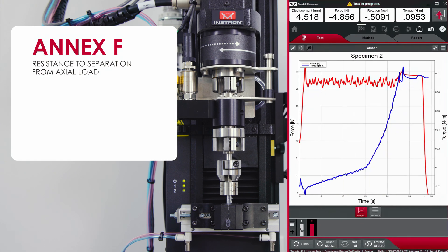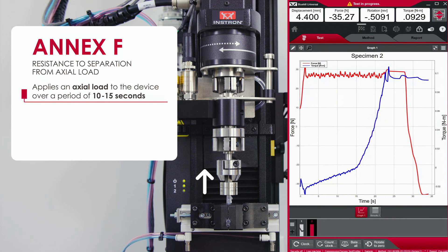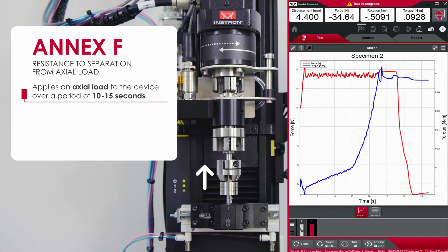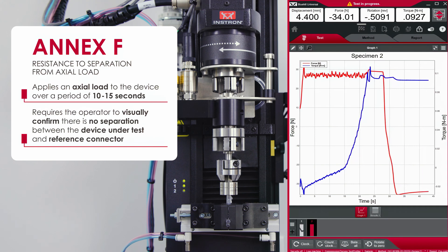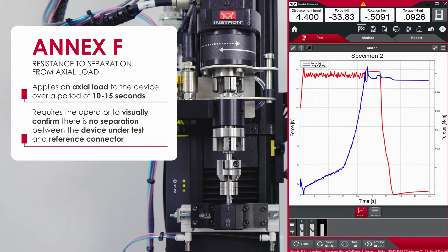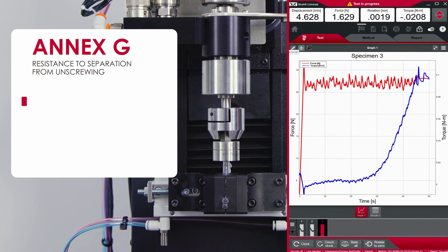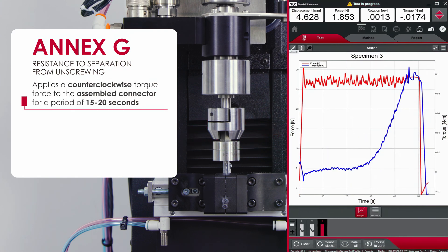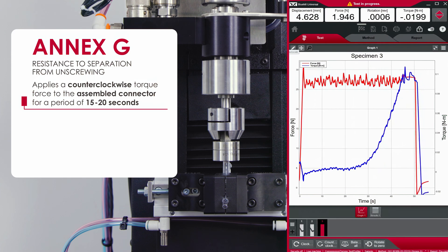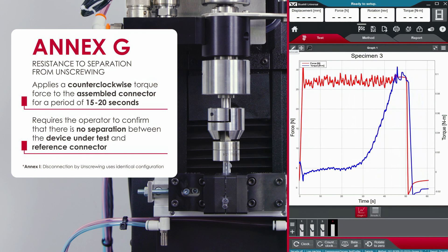Annex F, resistance to separation from axial load, applies an axial load to the device over a period of 10 to 15 seconds and requires the operator to visually confirm there is no separation between the device under test and reference connector. Annex G, resistance to separation from unscrewing, applies a counterclockwise torque force to the assembled connector for a period of 15 to 20 seconds, requiring the operator to confirm that there is no separation between the device under test and reference connector.